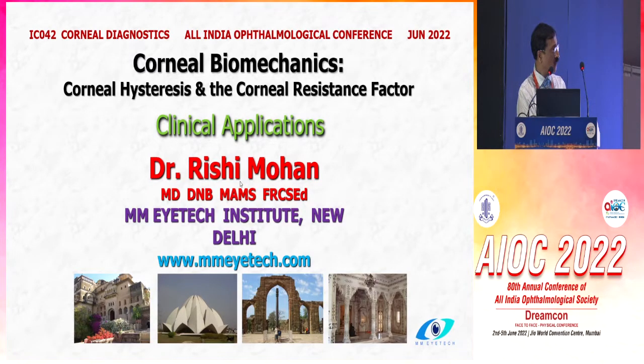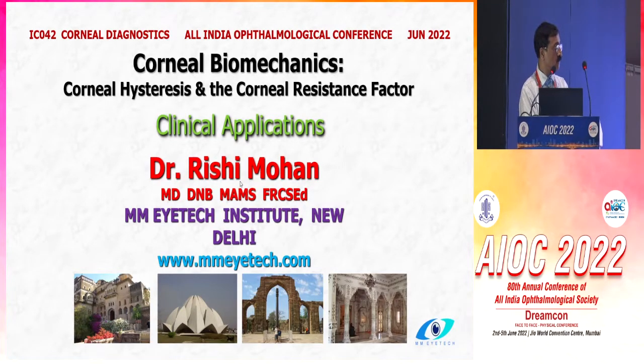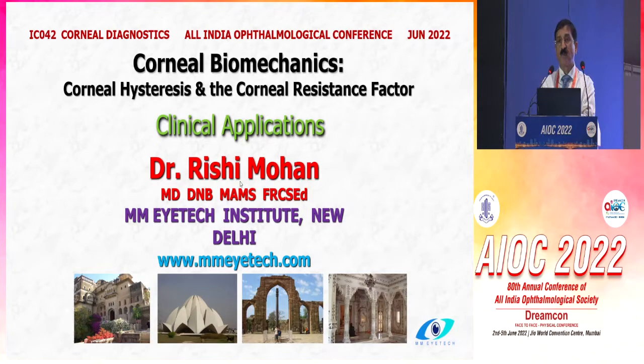Sir, although it puts a lot of load on the cornea lab to be doing it for each and every person, but especially for all premium IOL patients, now we are putting in a lot of enhanced monofocal lenses and all that. That's a must, I think, and actually it should be done for every cataract patient, no doubt. Every refractive patient definitely gets it done. So I think what is probably going to happen with time is that these technologies are going to gradually become what we call standard of care.